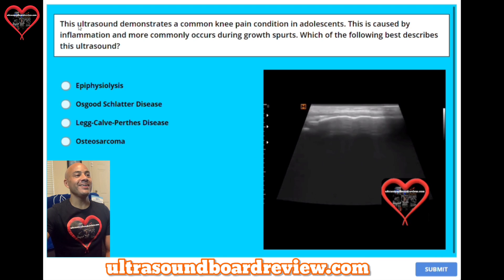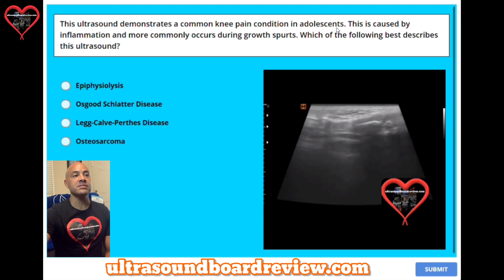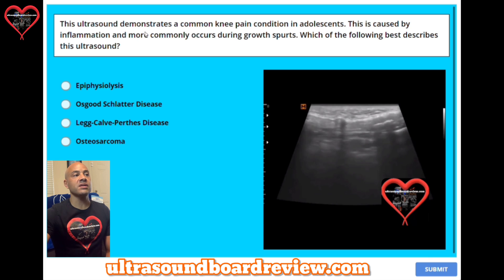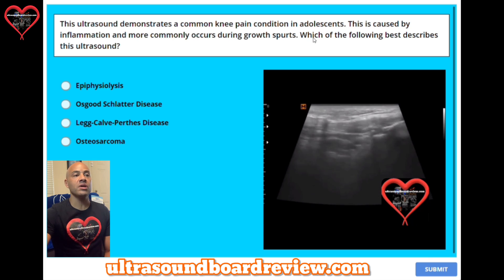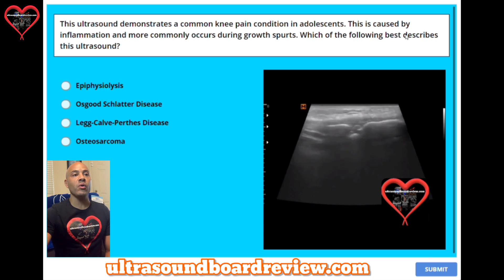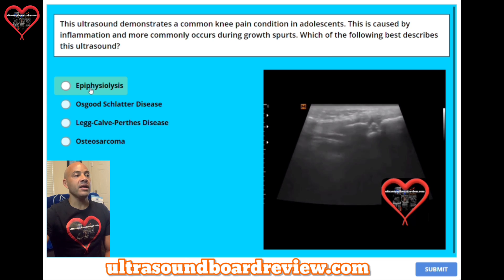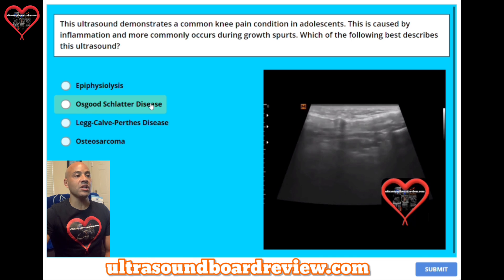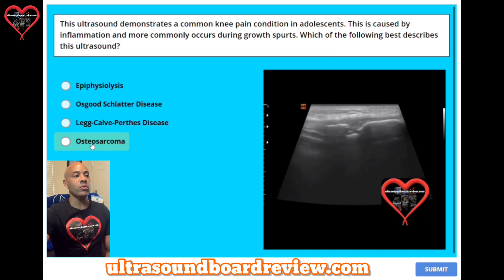Question 33. This ultrasound demonstrates a common knee pain condition in adolescents. This is caused by inflammation and more commonly occurs during growth spurts. Which of the following best describes this ultrasound? A: Epiphysiolysis. B: Osgood-Schlatter disease. C: Legg-Calvé-Perthes disease. Or D: Osteosarcoma.